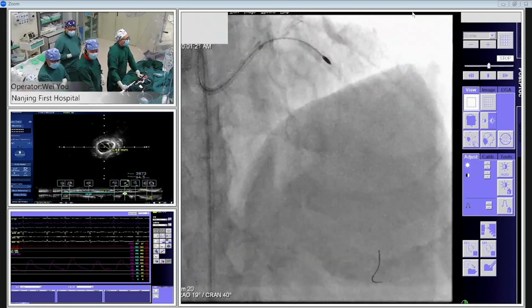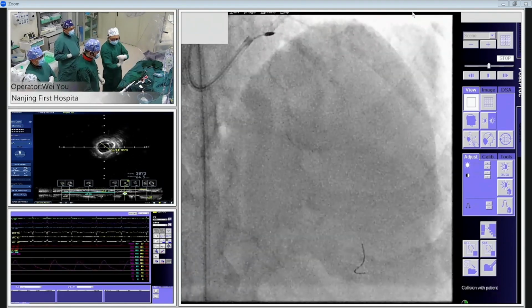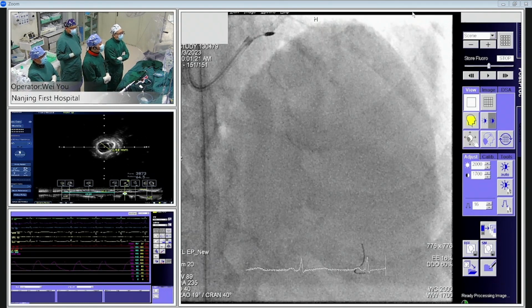160,000 RPM. The speed is maintained very stable. It takes less than 15 seconds. We just give an interval for the fluid infusion to the distal LAD. The patient is stable and the hemodynamics are stable without any ECG change. Then we stop and restore the blood supply to the distal myocardium. Then we start the rotablation again.